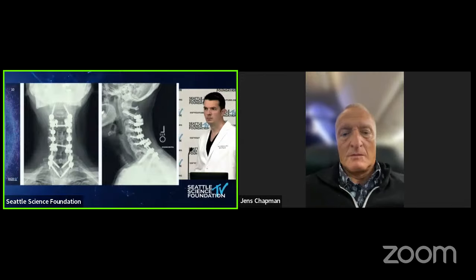And the reason I said there were 100% chances, what are the risk factors? Myelopathy, kyphosis or deformity, and then the patient had prolonged surgery. And they're going to get it. I think you just have to, as you guys did, decompress the nerve and be sure that it's not being compressed. If it is compressed, then that's another issue. But Jens, that was a beautiful reconstruction for a very difficult case.